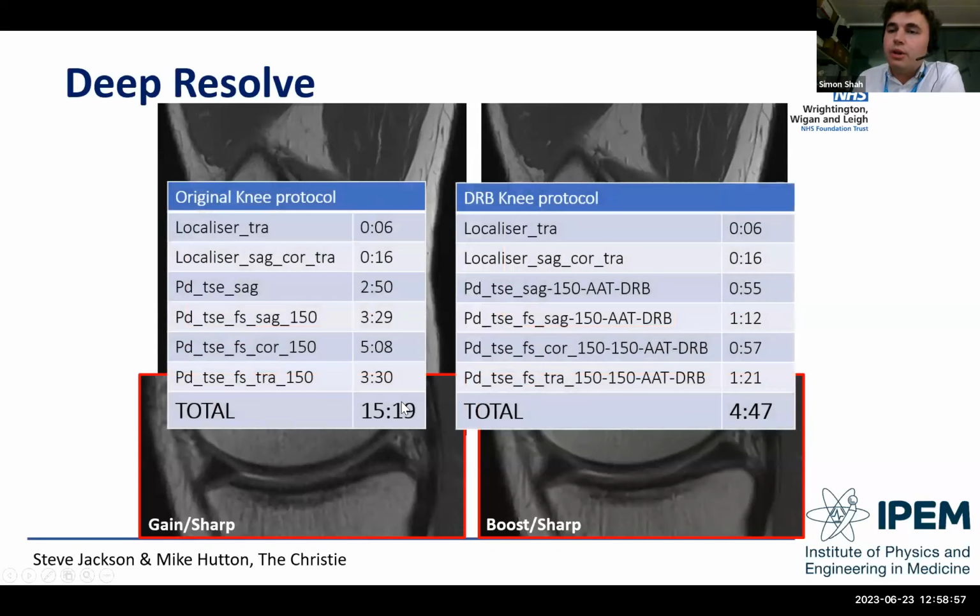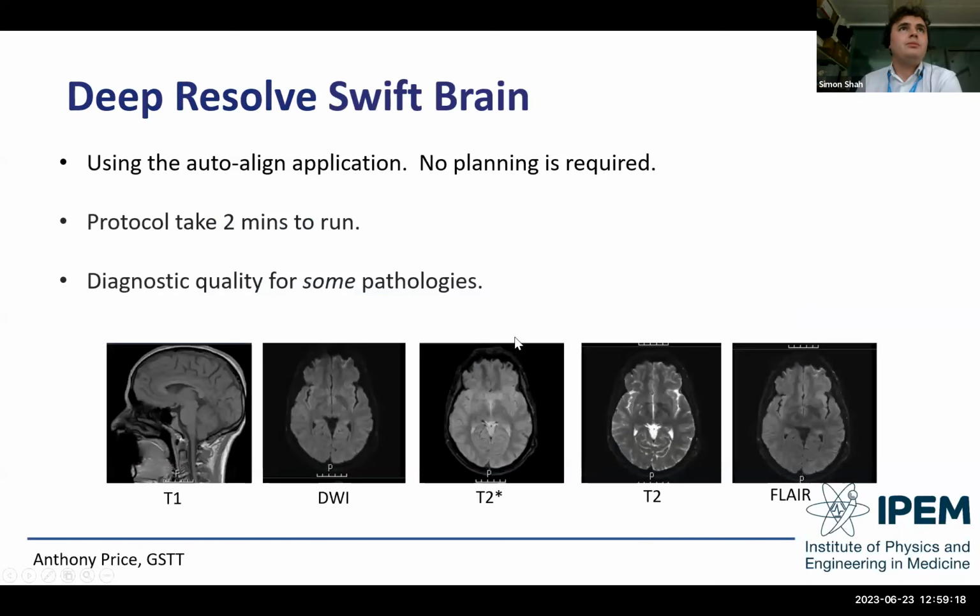And if we look at the protocol that they optimized over time, they went from their original knee protocol in this hospital, which was a 15-minute scan, and got it down to less than five minutes, obviously not accounting for time in between the scans. So you can see why it's impressive and why people are very interested in this technology.